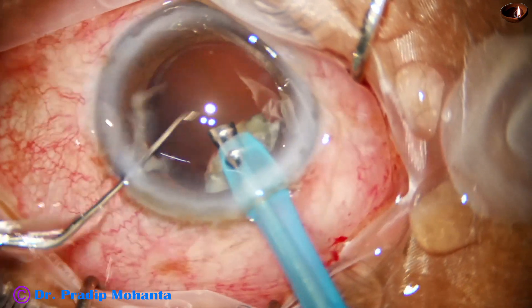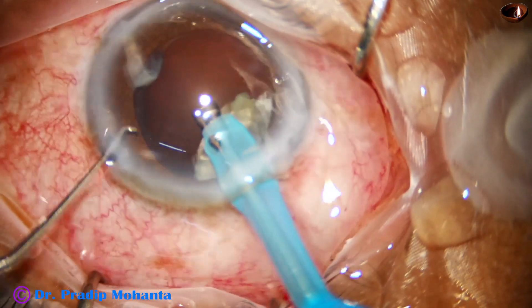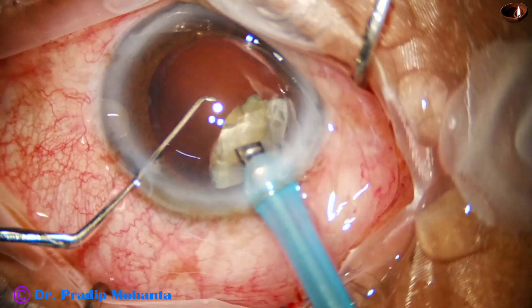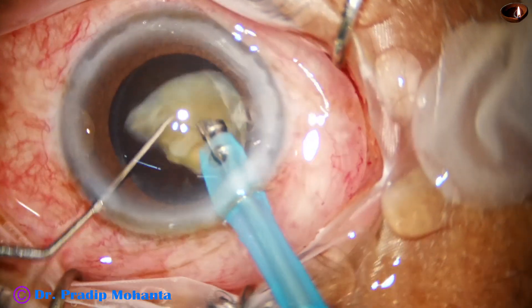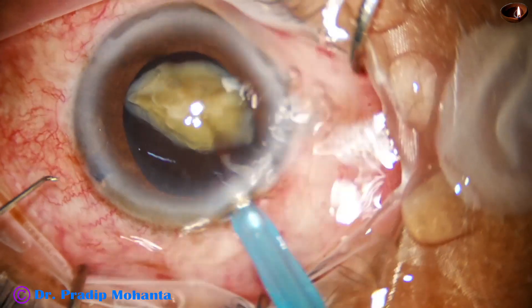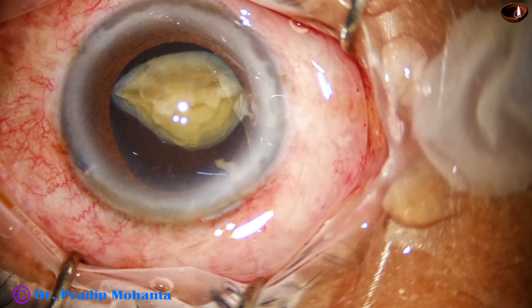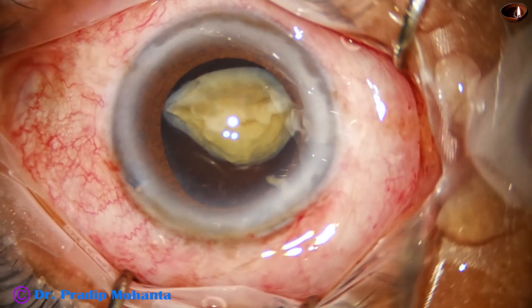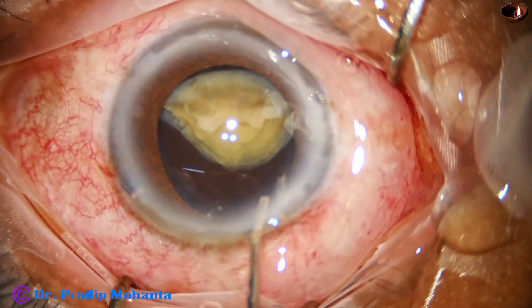The phaco needle is positioned well away from the anterior capsule and kept in a position far from the cornea. For the last nuclear piece, the IOL scaffold technique will be employed.